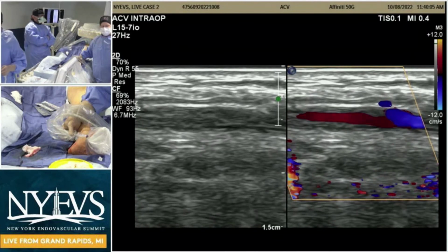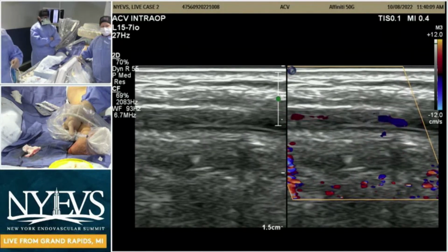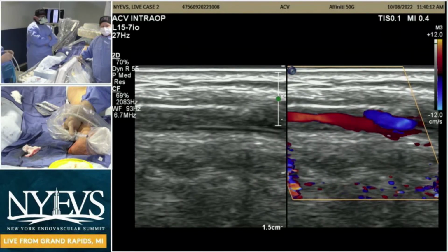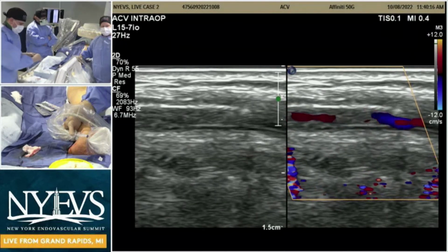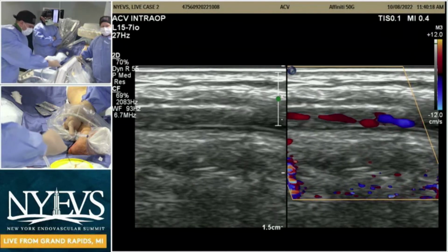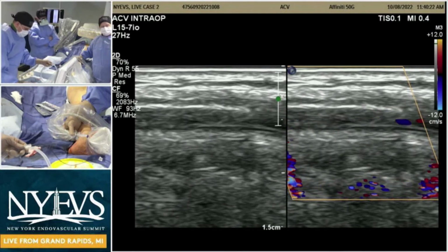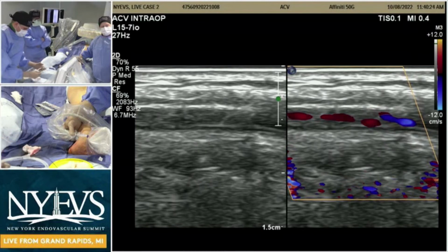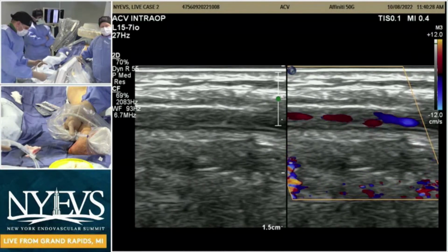Oh, well, Fadi, I just had a question about the IVUS. The whole idea with the revascularization is to achieve physiologically significant flow to achieve wound healing. But I've not seen a single piece of data which says that this much amount of area stenosis improvement with IVUS correlates with wound healing. Because at the end of the day, that's what we're trying to achieve.